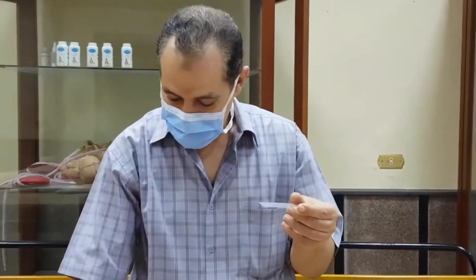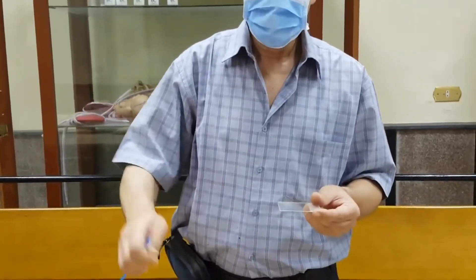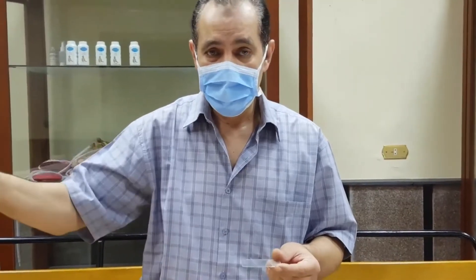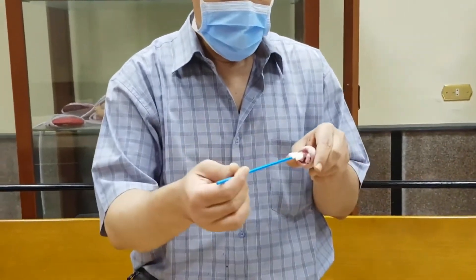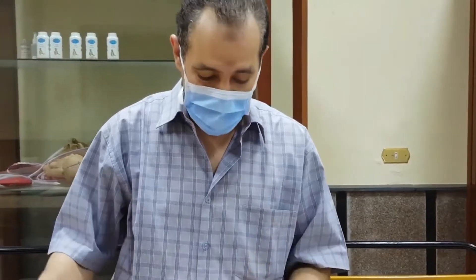This is another way for the cervical smear: to put it inside a saline bottle and send it to the lab for cytological diagnosis. So either spread it on the slide and fix with the spray, or put it inside a bottle containing saline, close it, and send it to the lab. This is the use of the cytobrush. Another cytobrush — the head is very small and round — you can insert it inside the endocervix and rotate it also 360 degrees, same as before, and send to the lab. This is the end of my discussion about cotton swab for infection and cervical smear with cytobrush for CIN.